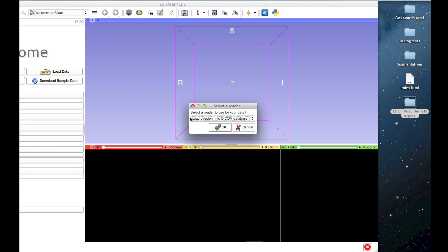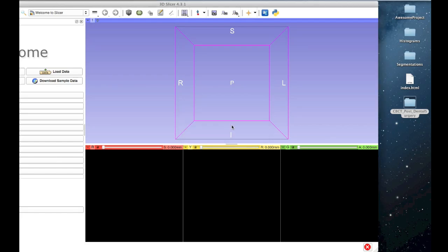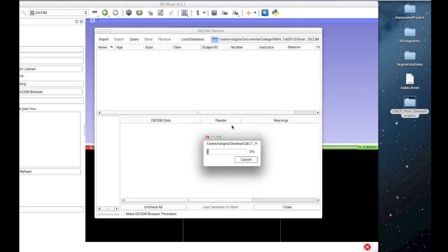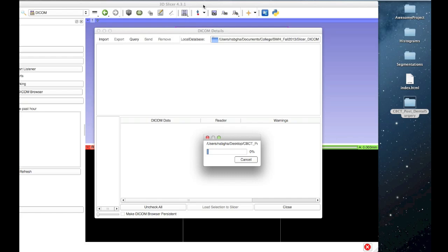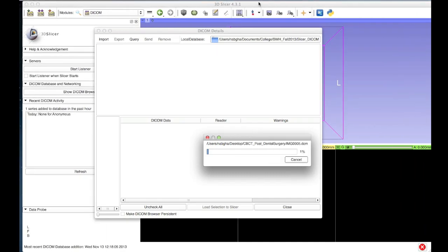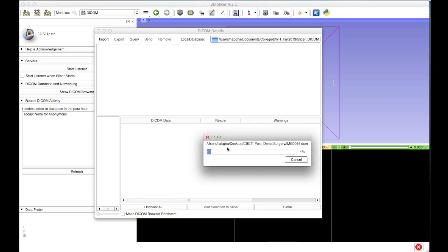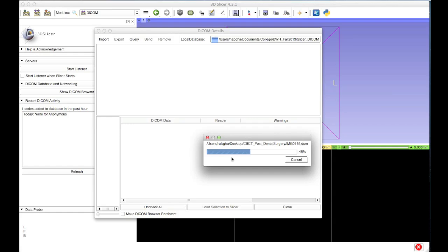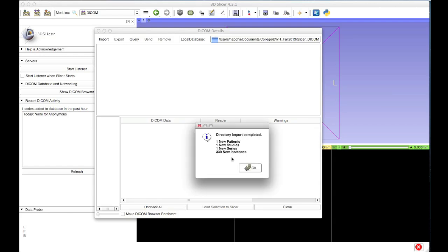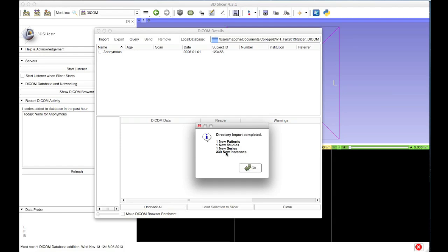In this case, I get this dialog box asking whether I want to load my directory into the database and I'll click OK. When I do that, the module automatically changes to the DICOM module, which you can see on the left side of my Slicer interface, and this window called the DICOM browser automatically pops up. So now my data is uploading into that DICOM browser, and once this upload is complete a second dialog box will appear. There it is — it will give you a summary of the information that you've just loaded, so I'll click OK.